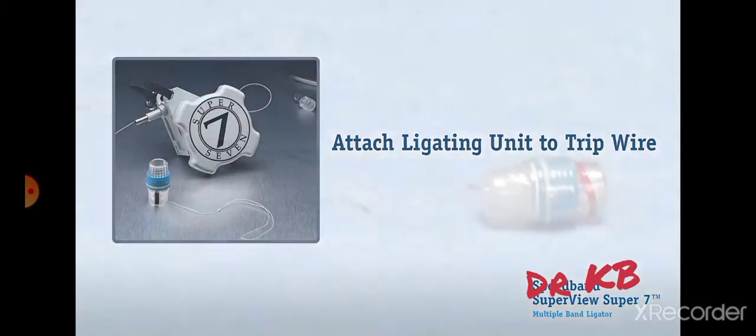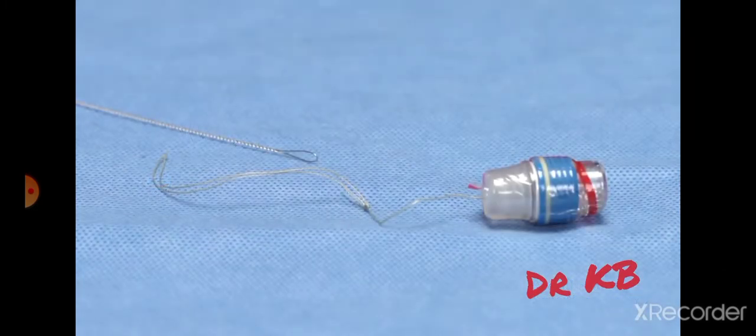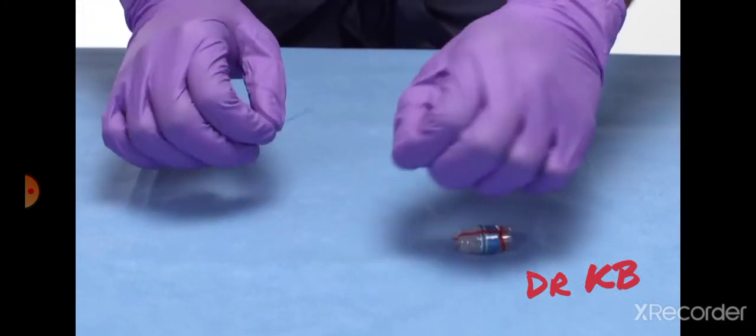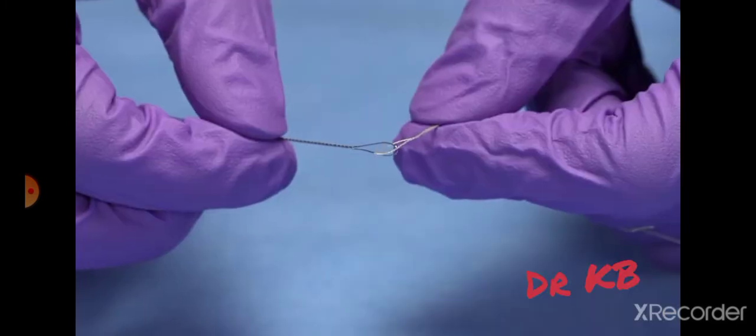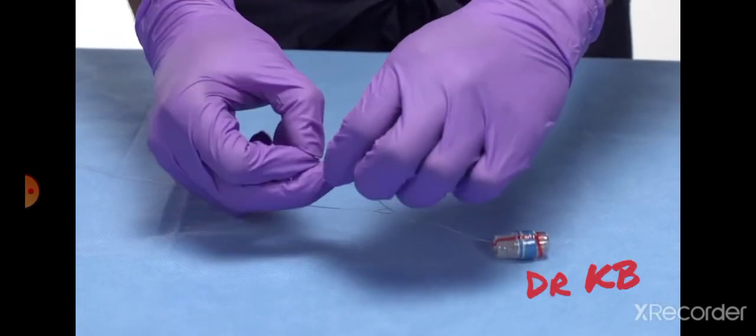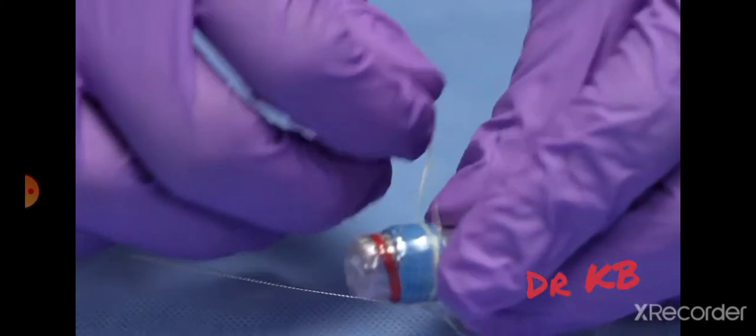Next, attach the ligating unit to the tripwire. Attach the pulling loop of the ligating unit to the wire loop connector on the distal end of the tripwire by threading the pulling loop through the tripwire loop. Then thread the ligating unit through the pulling loop. Pull to tighten.